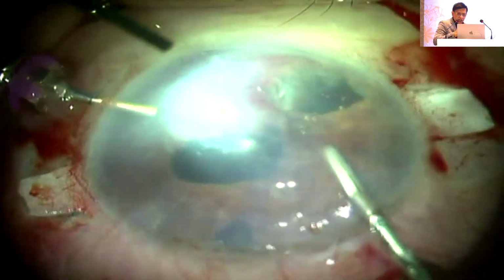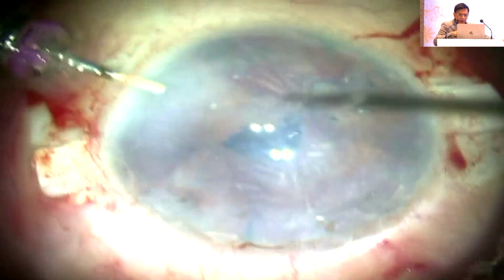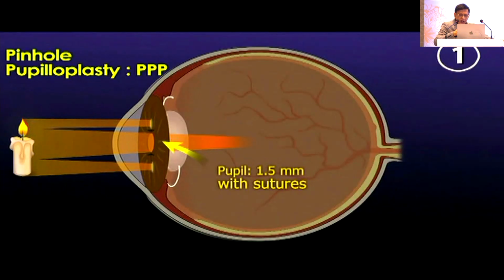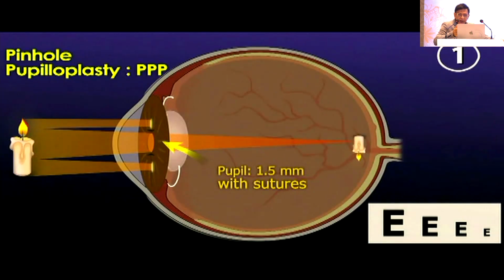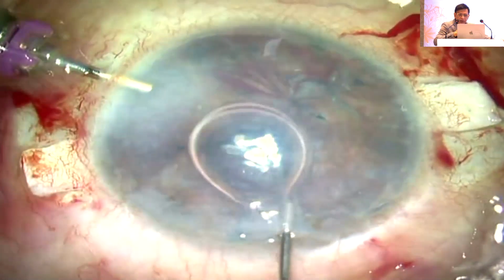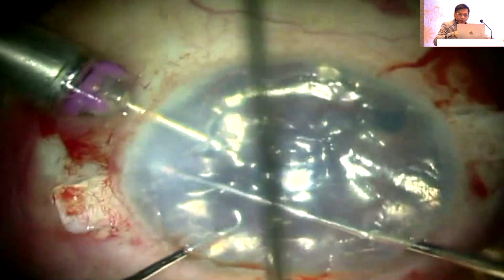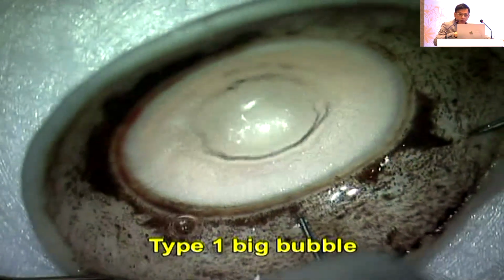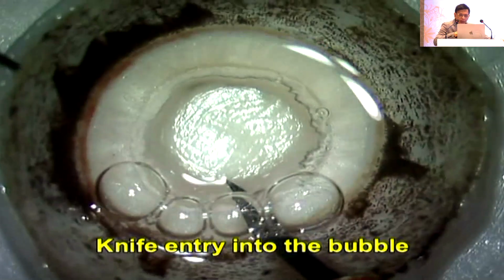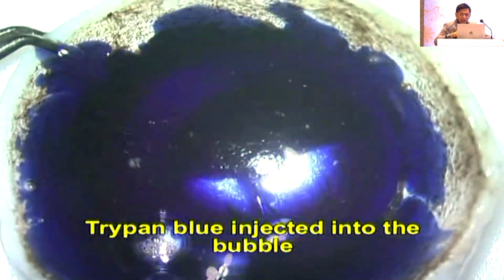Once I've done this, you will see me now completing that pinhole pupil there. My Purkinje image is pretty okay there. Now all I do is, remember that I have to take off the remaining Descemet's endothelial complex. Most of it was already removed by me before itself, but anything remaining, I'm just checking it. I've got continuous air infusion from the trocar AC maintainer. Create my PDEK graft just like I talked to you before. Once my PDEK graft is ready, I take it, inject it inside.